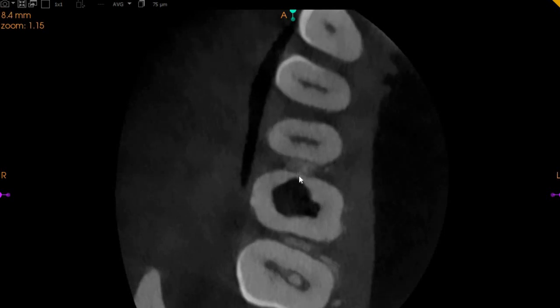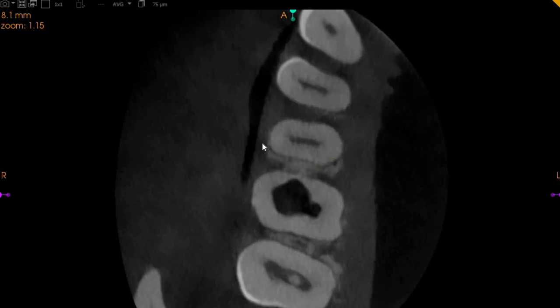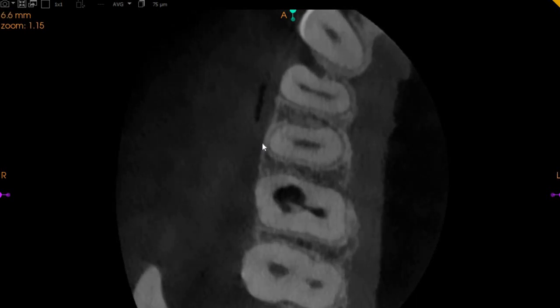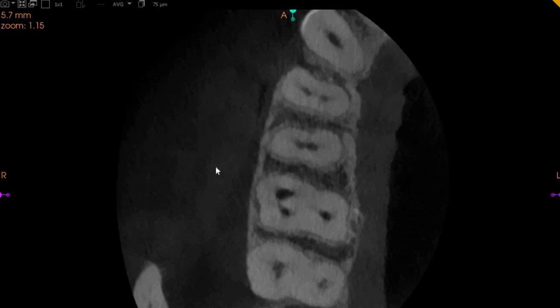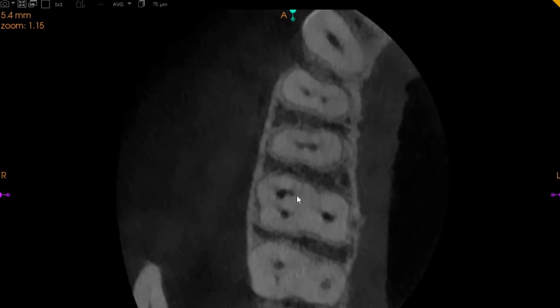You can very clearly see the chamber opening is very close to creating a perforation in the mesial aspect of the tooth. This is supracrestal, so it's not going to be a problem — this is where the crest of the bone starts. We've got a slight architecture, so you can actually see this is the MB1, this is the distobuccal, and this is the palatal.